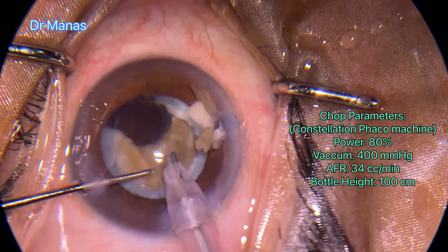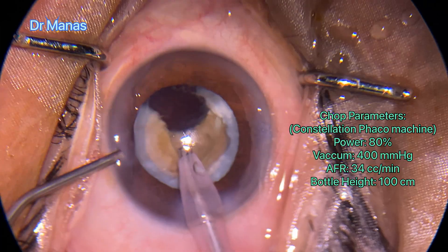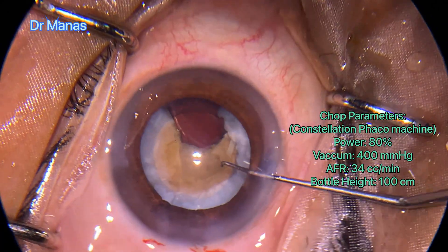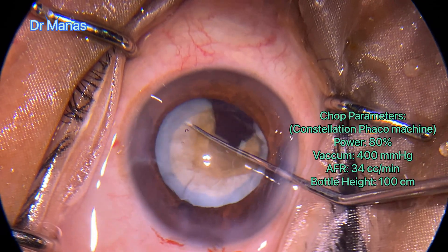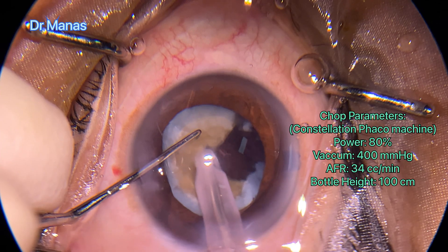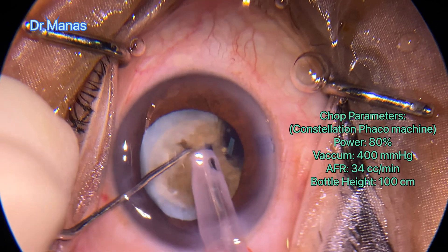The cortex in the periphery is also kind of calcified. Using the Sinskey hook from the outside, I rotated it gently and then continued with the chopping.